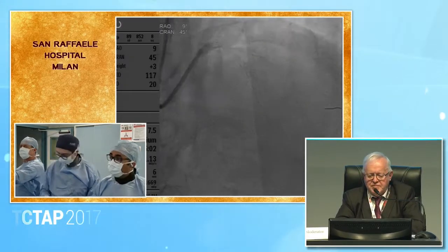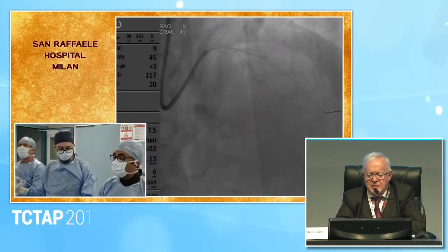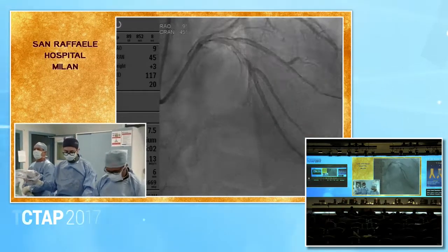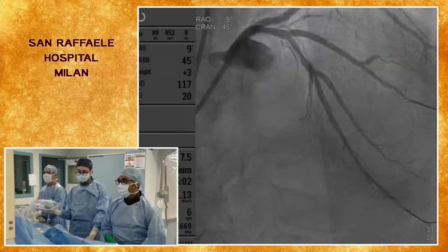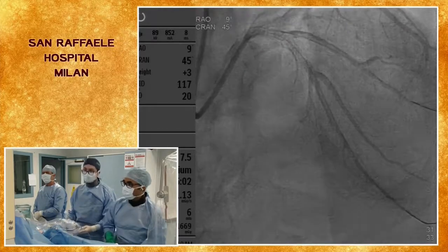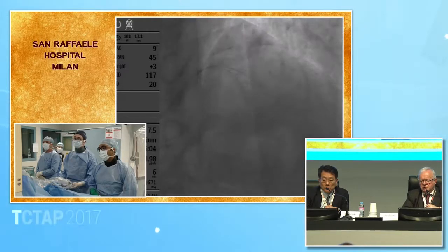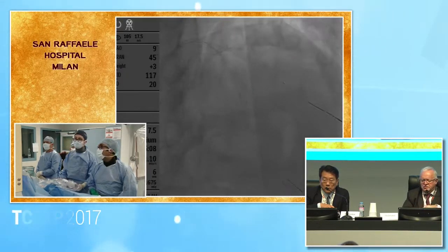Yeah. Okay. The nice thing about a long drug-coated balloon is that if the result's good, we don't have to recross or do another kissing. You mean a long stent, from the LAD to the second diagonal? Yeah, so the option is a long drug-coated balloon from distal to the second diagonal to proximal LAD, versus a long stent, and it will be a double culotte with one long stent in the LAD.